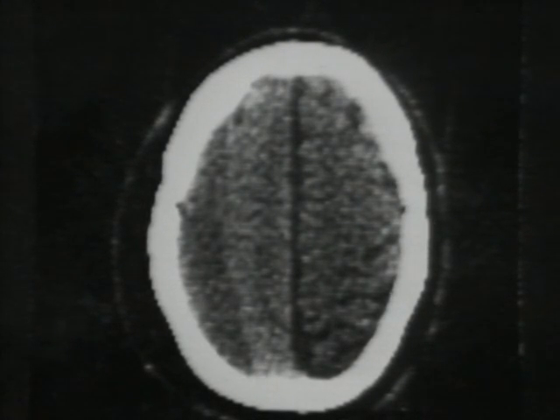As one would expect, subdural hematomas vary considerably in consistency. Those hematomas which have a thin, watery consistency are seen as characteristic low-density crescents capping the cortex. Where the consistency is thick and tarry, the hematoma may be more dense than the underlying brain and shows as a dense crescent. Other subdural hematomas, with the same average density as the underlying brain, may give rise to difficulty in the diagnosis.